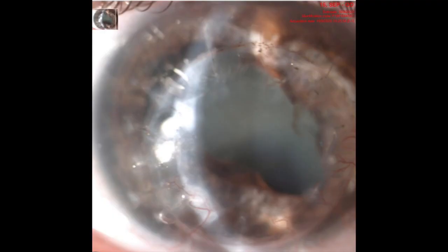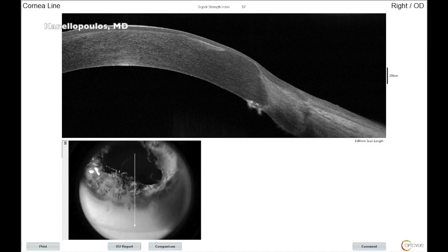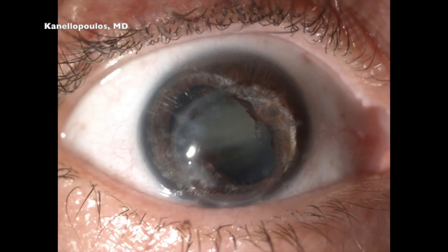He was a keratoconus patient who had a transplant, as you can see here — this is from 2020. There are a lot of loose sutures and neovascularization, clearly visible. We can see the graft-host interface at the limbus inferiorly. This was a decentered graft performed elsewhere in Athens — you can see how inferonasal this graft is — and the iris was significantly traumatized, causing some irregular dialysis.